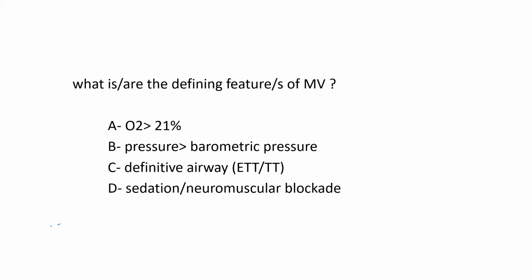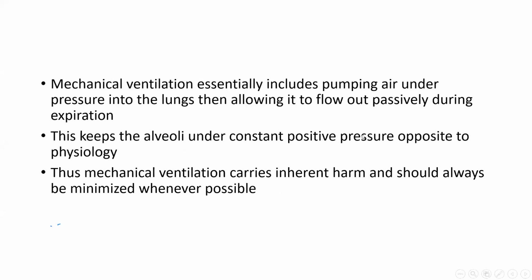So the essential component of mechanical ventilation, the only essential component of mechanical ventilation, is pressure. So mechanical ventilation essentially includes pumping air under pressure. Now, if you remember the physiology, the alveoli are always under negative pressure. During inspiration, you inhale atmospheric air under negative pressure, and you exhale passively under zero pressure during expiration. So mechanical ventilation goes directly opposite to the norm, opposite to physiology.